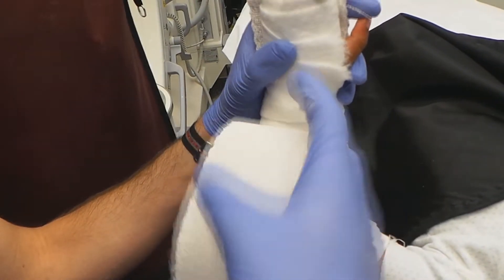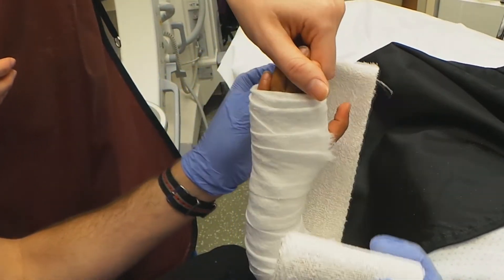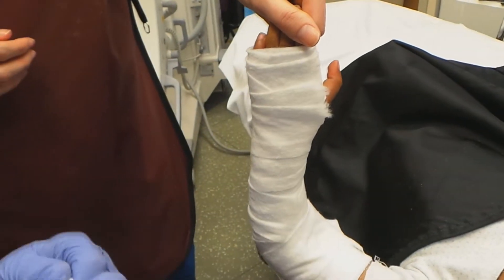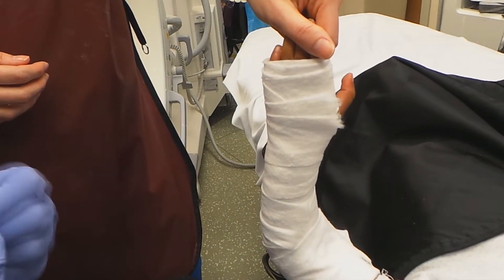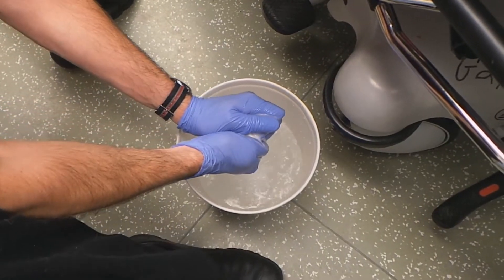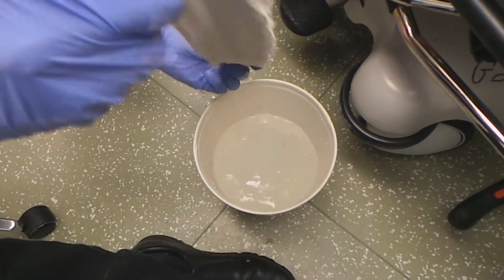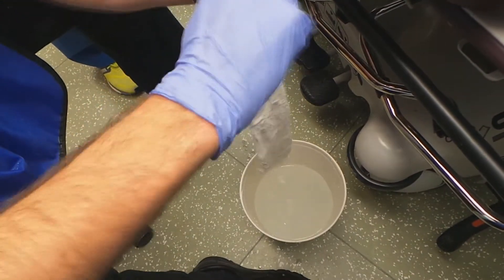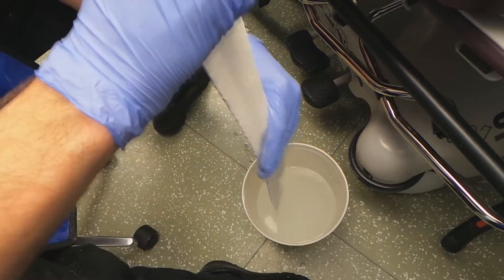I like to have my splint material pre-measured purposely long, because if you measure and tear it prior to splinting, oftentimes your plaster will end up short due to the thickness of the web roll. Cut out a good thumb hole. You want your water to be cool to warm, but not hot. Squeeze out the excess water over the bucket so you don't make a mess. After you've squeezed the water out, laminate the individual plastered leaflets to one another.